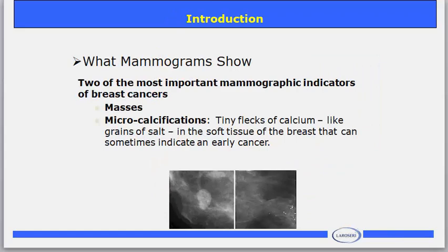Mammograms can often show a breast lump before it can be felt. They also can show microcalcifications or masses, where calcifications are tiny mineral deposits within the breast tissue. They look like small white spots on a mammogram, while a mass is the same as a lump or a tumor with or without calcification. It's another important change seen on a mammogram.